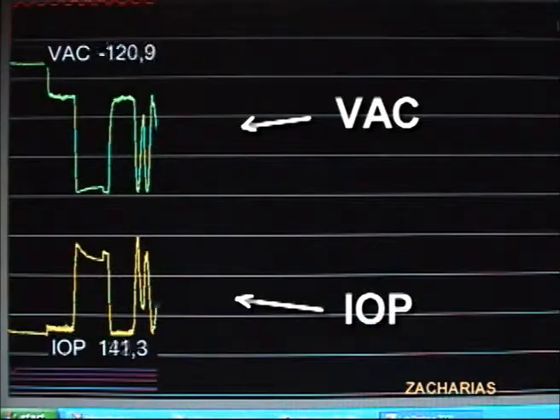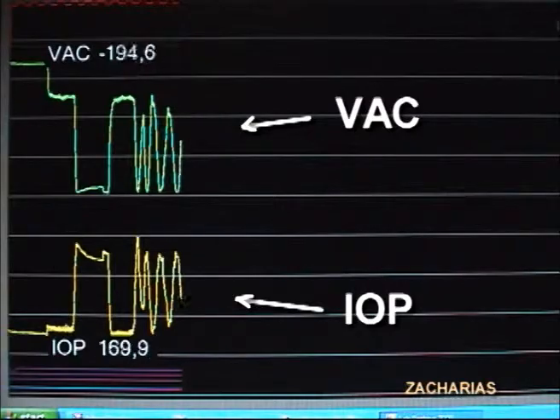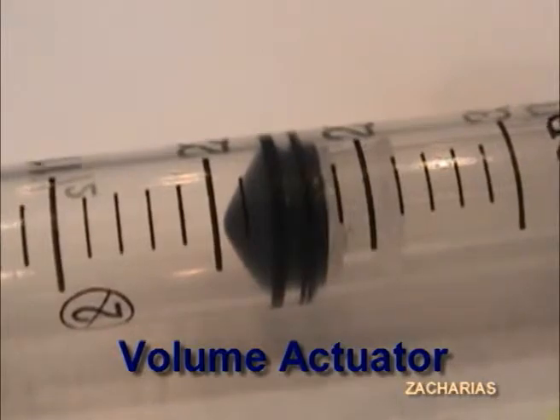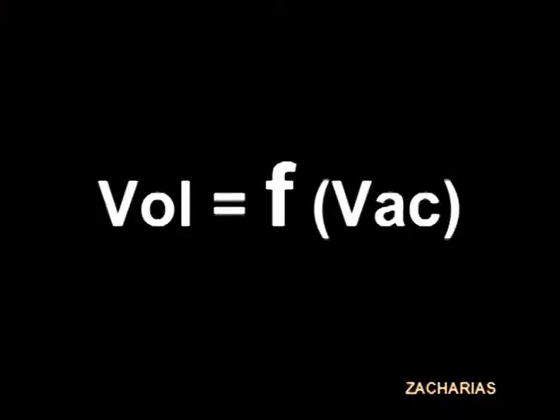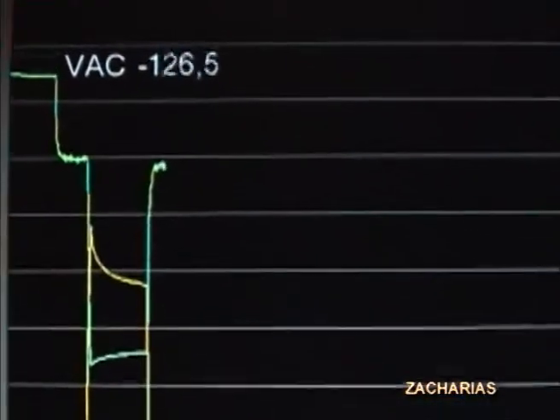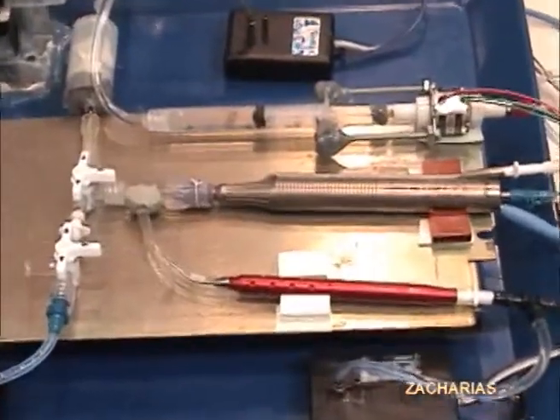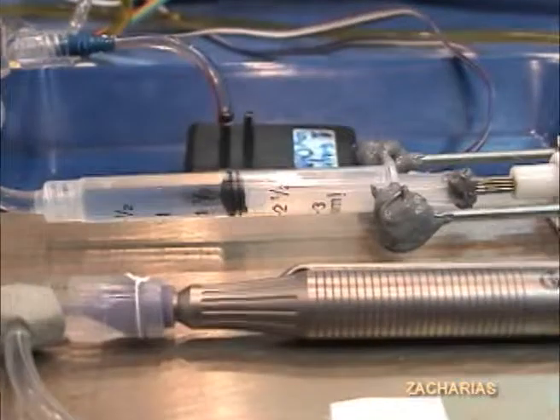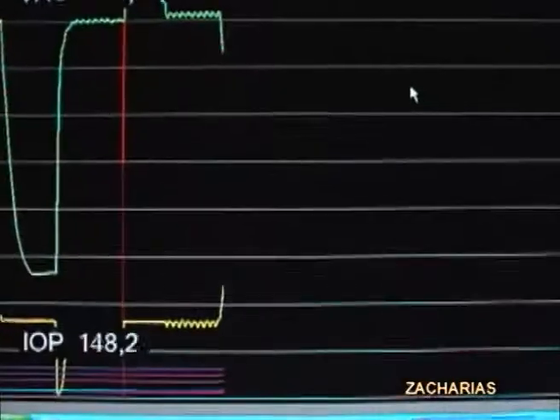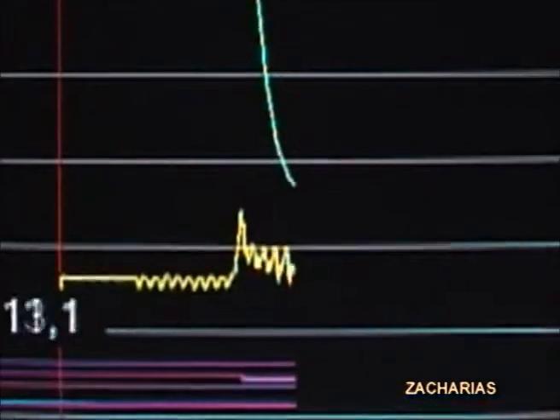A complementary approach to solve the problem of IOP rise on occlusion was the incorporation of an active volume compensator in the positive pressure side of the fluidic loop. A formula determining the excess volume responsible for IOP rise as a function of vacuum was developed. A linear actuator was used to drive a plunger reacting to vacuum readings to compensate the volume shifts that produced the IOP rise. Reducing the response time of our dynamic compensation system will also allow to cancel the pump roller spikes observed in the irrigation line.